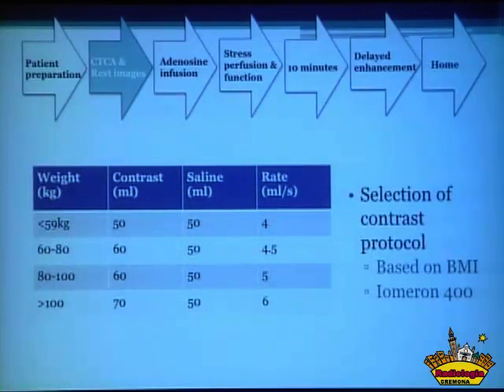For the contrast protocol, we use Iomeron 400 contrast agent, and select the volume and rate of injection based on their body mass index as well.